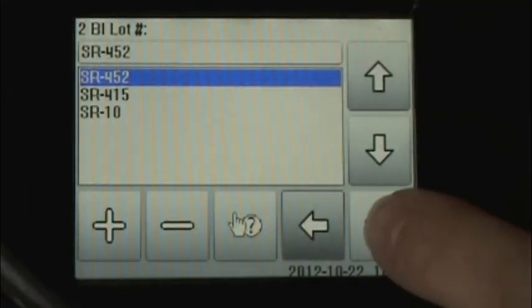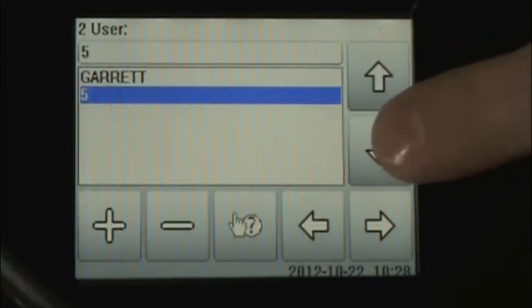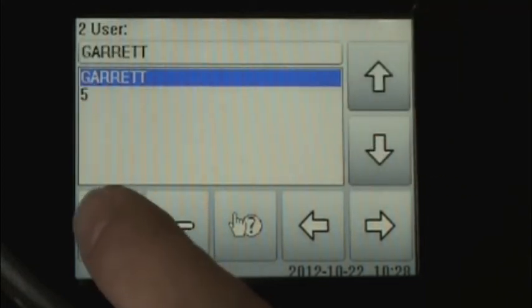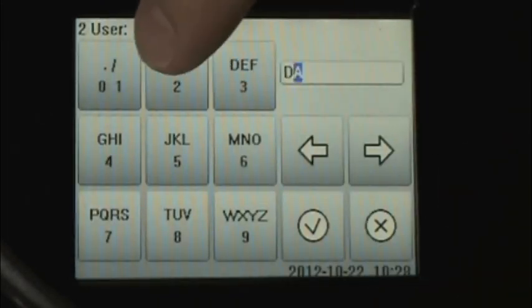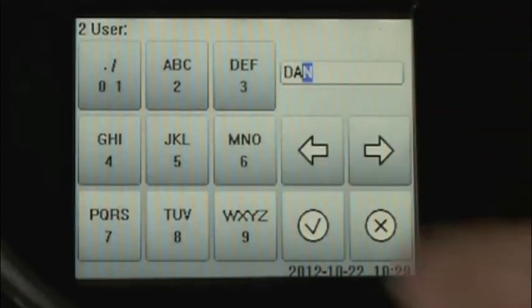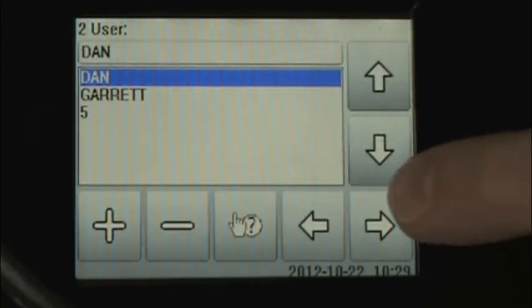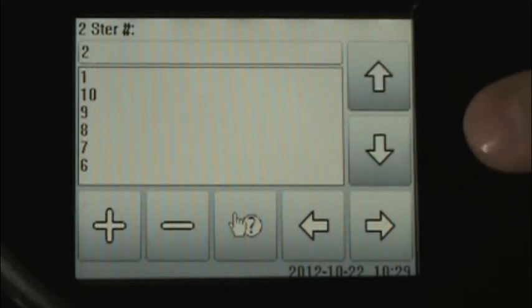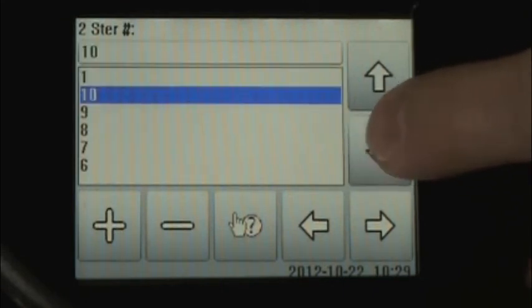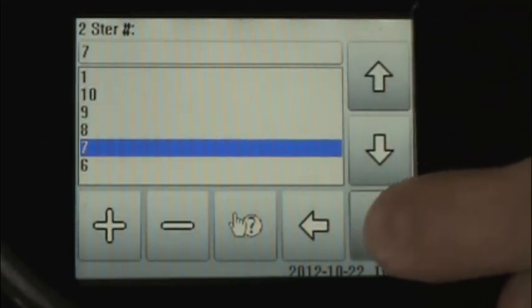SR452 shows up, and we forward to the next field. The incubator will also remember user names, so if the name is correct, we can simply select, or we can add a user — Dan — and click the check mark. The next item to enter is the sterilizer number, and again, the SmartWell incubator remembers previously used numbers. So we can toggle to the appropriate sterilizer number and click the forward button.